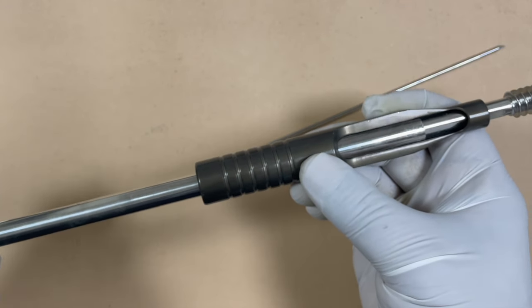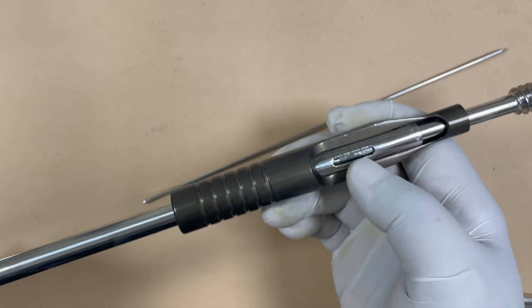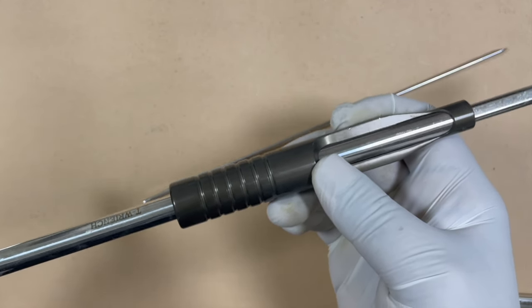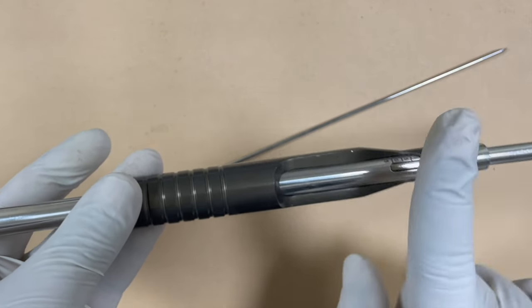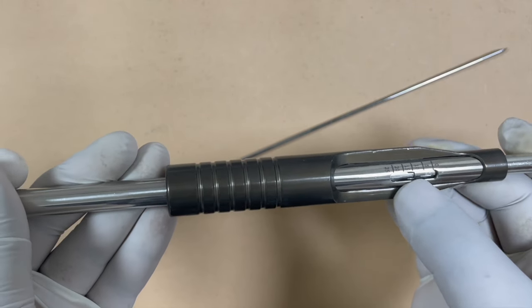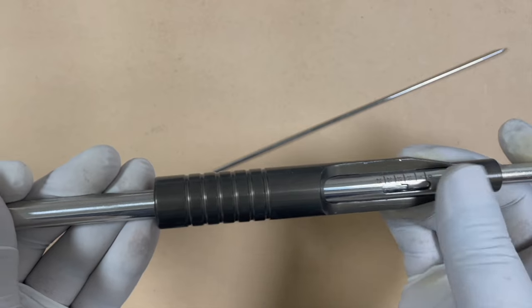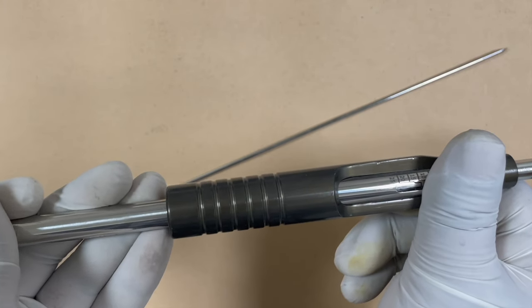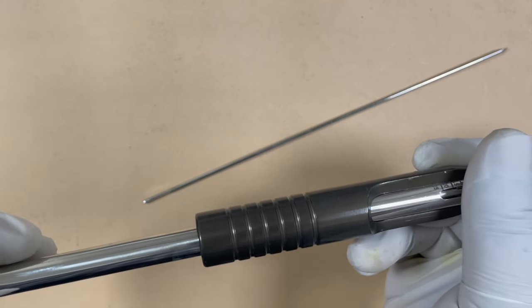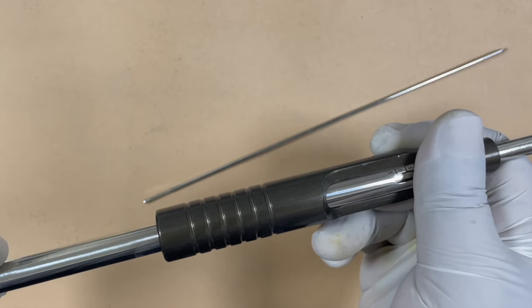When you rotate the T-wrench it actually rotates the lag screw. Through the sleeve you can see the junction of the coupler device and the lag screw, so as you go inside the bone you can tell how much lag screw has been inserted. You can slightly loosen the T-wrench outwards to view the locking area between the coupling device and the lag screw — that junction tells how much the lag screw has been inserted. You can give a few more turns to advance it further, and verify position with C-arm.